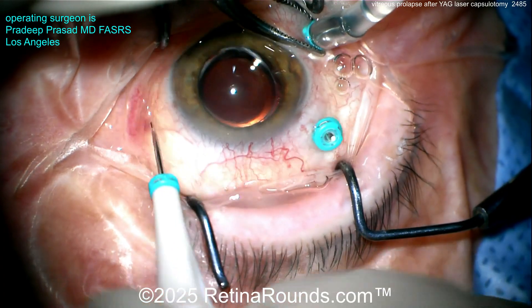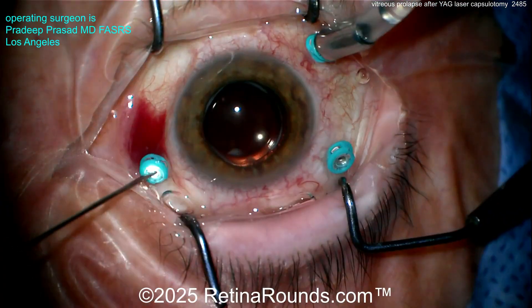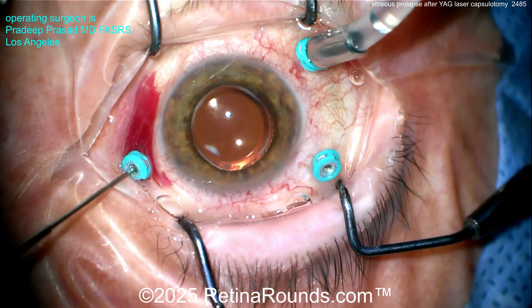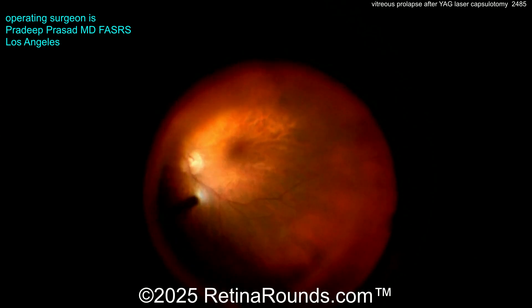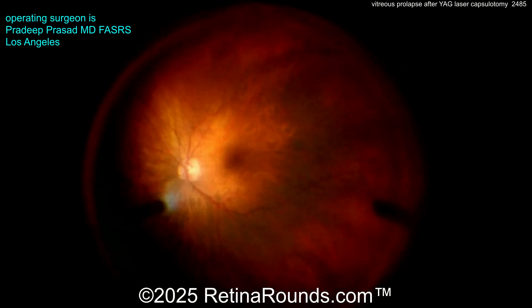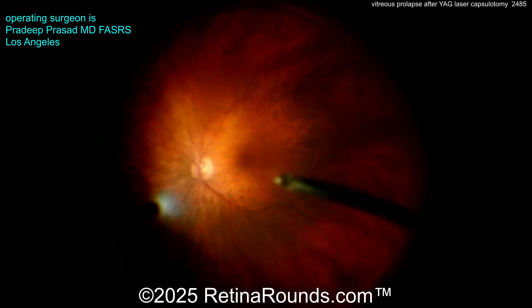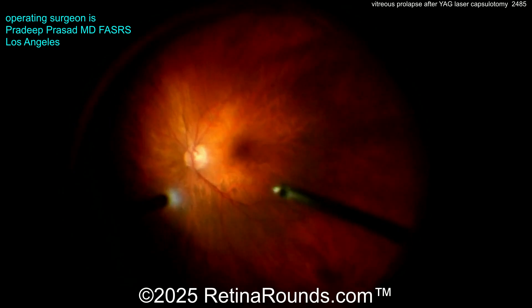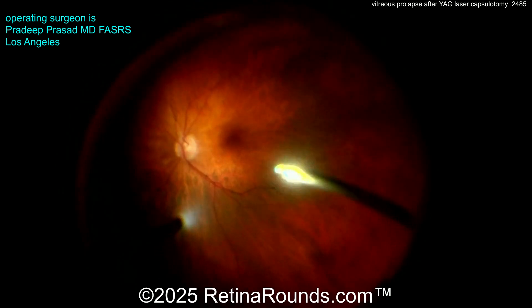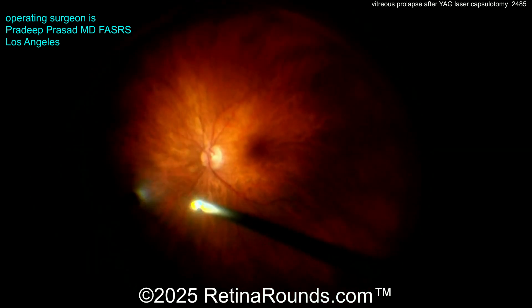We're going to approach this patient's problem with a posterior approach, doing a standard three-port pars plana vitrectomy. This is a 25-gauge setup. You can see the light pipe and cutter being introduced through those trocars, and we're going to start with a core vitrectomy. You can see that those capsule remnants are being removed right away.